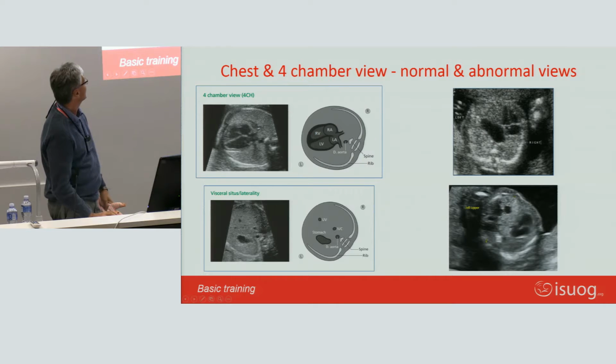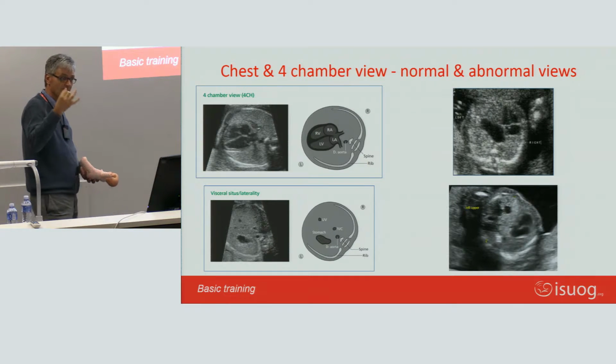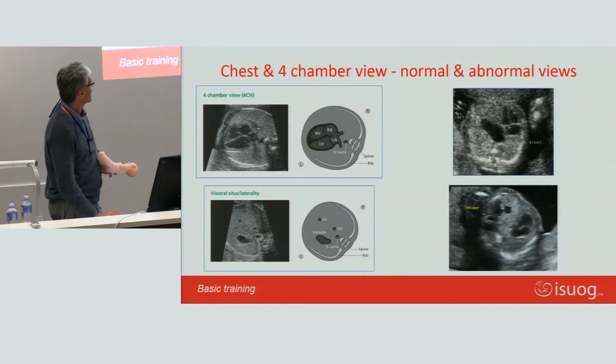There's the left lung to the left of the heart, there's the right lung to the right of the heart, and they're all pretty much equal. So that's basically, I have to count to 3. Lung, lung, heart. And then inside the heart, you have to count to 4. You see, 1, 2, 3, 4 chambers with valves in between, and that's the heart, basically.